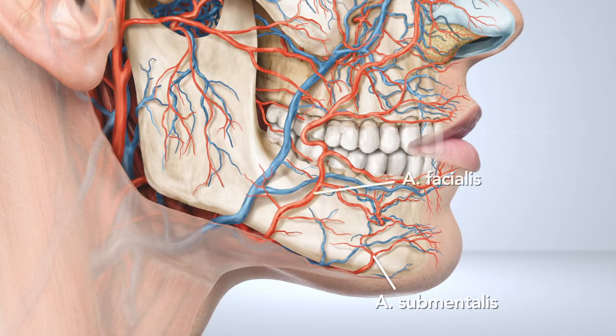The main anatomical precautions of the injection concern the inferior labial coronary artery, if it has a particularly low anatomical variation, the facial pedicle laterally, as well as the chin sensory nerve.